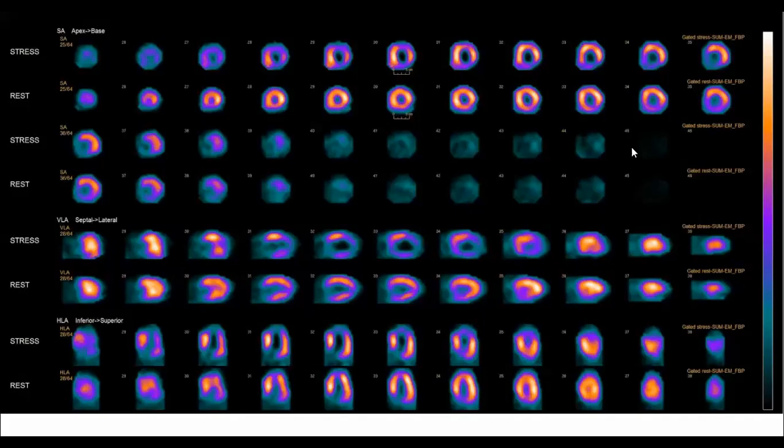Very good. Arshad, you have missed one thing, actually two things. Abrar only noticed one thing, the dilation. You don't write dilation of LV or cavity dilation. You write it as stress-induced cavity dilation. Use of proper terms is important.